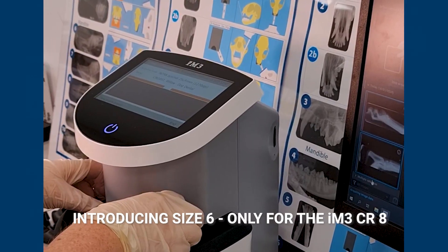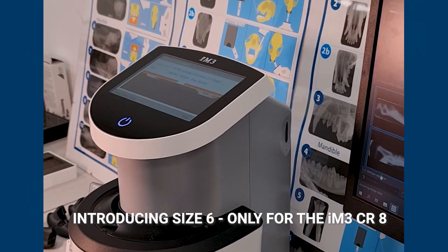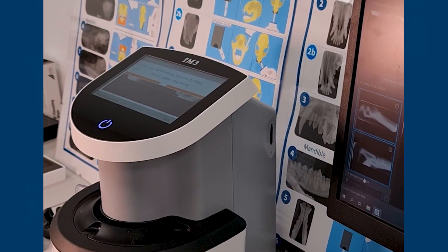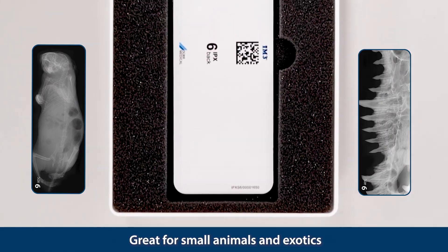Introducing size six — only for the IM3 CR8. Great for small animals and exotics.